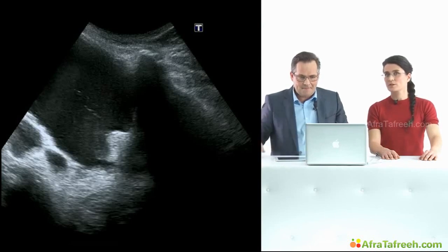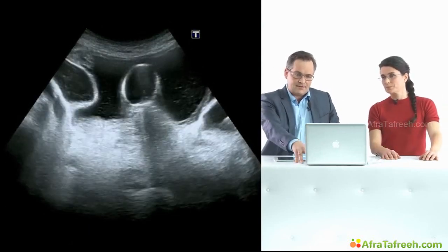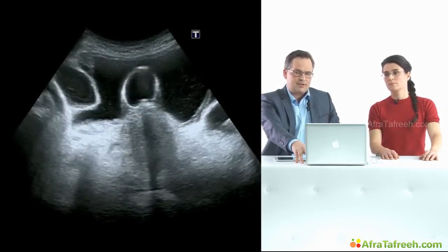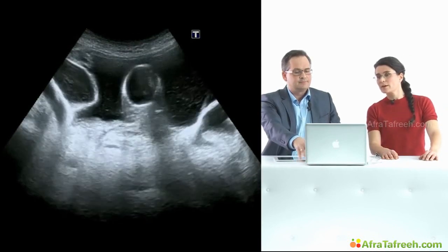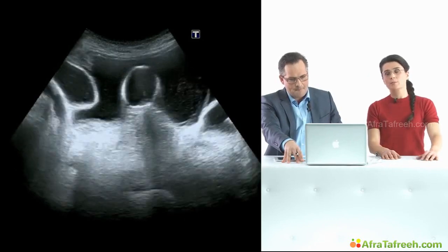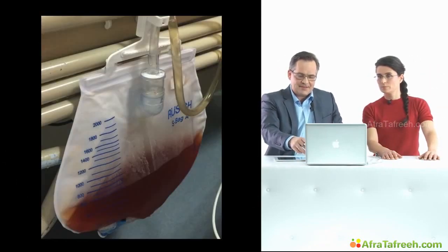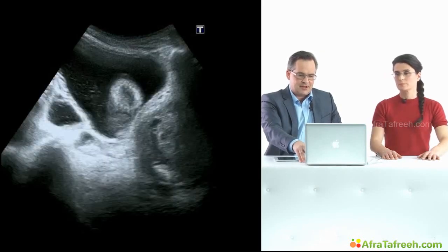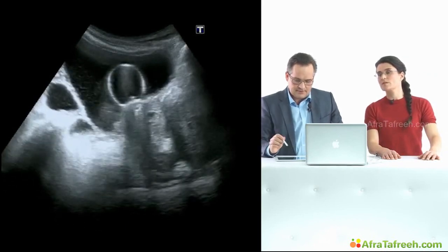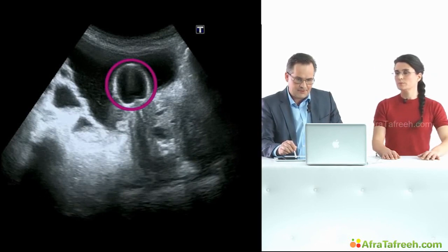So you repositioned the urinary catheter, I suppose, as we can see here now. This was not really easy because the patient also suffered from a remarkable hyperplasia of his prostate. But I can see beautifully the urinary catheter balloon here now. And isn't the bladder already getting a little bit smaller? Finally, we did it. And now the success, there's urine in the collection bag and there is the catheter balloon over here. Again, we can see this urinary bladder. Over here. And here, the balloon.